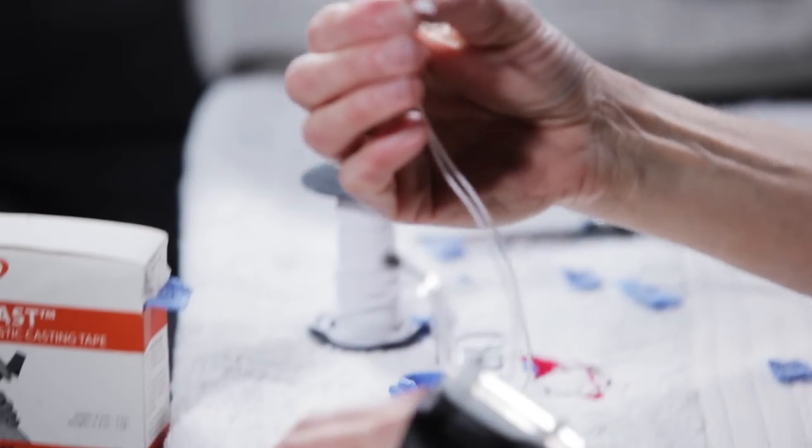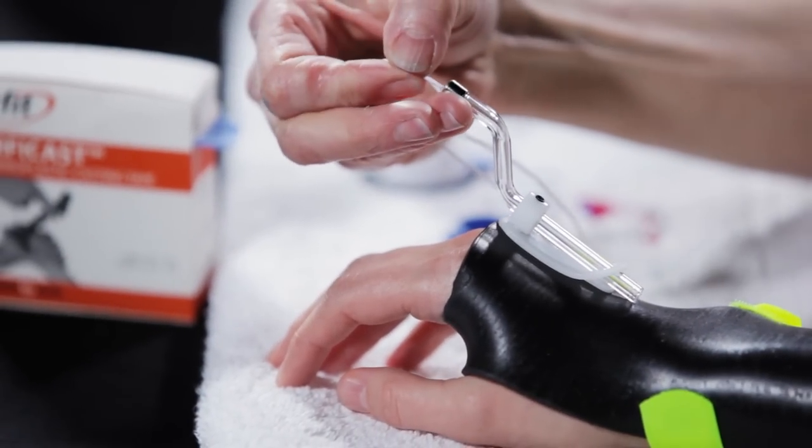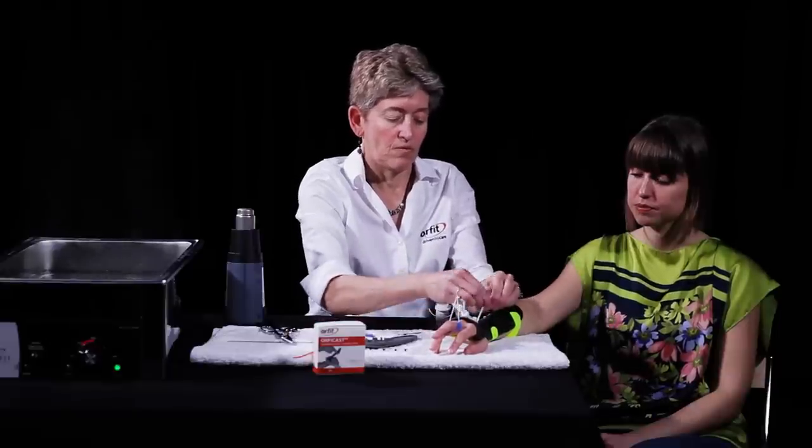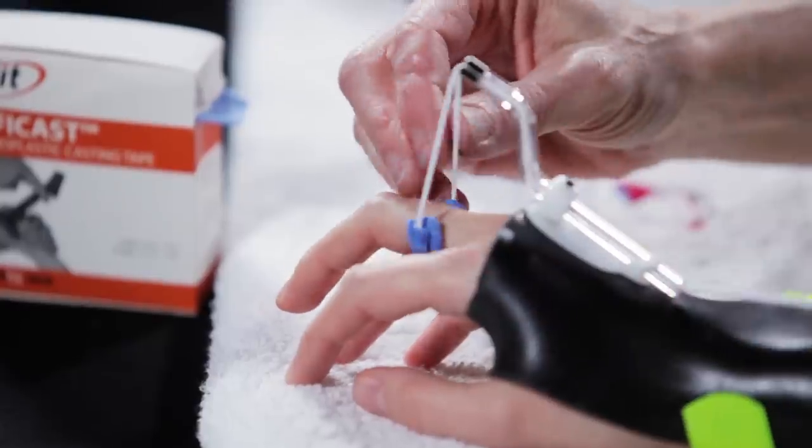Trim the elastic threads and thread through the OrphiTube. Tie a knot in the elastic threads so they don't slip back through the OrphiTube.